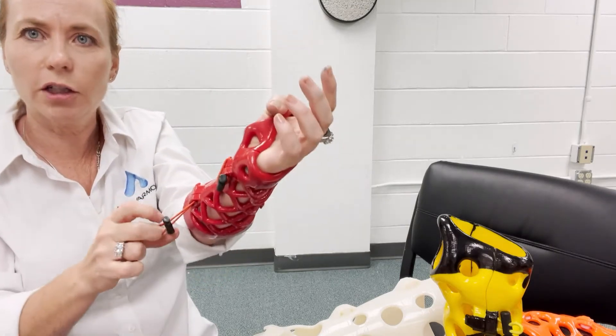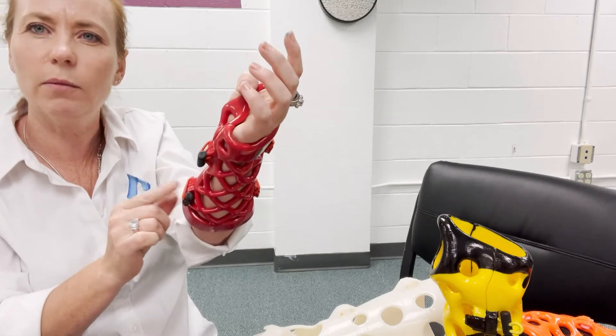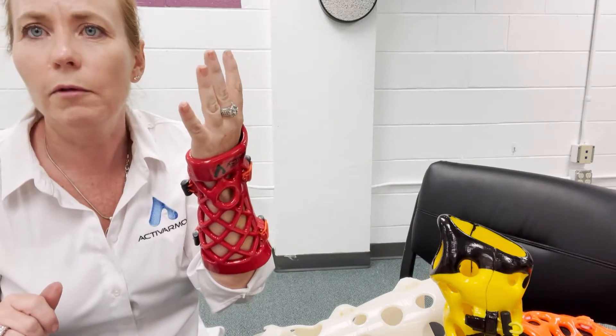Super easy to put on and off. Make sure they snug that toggle right up there, put that loop over the hook, and then you can push that little toggle out of the way. That's how you put on and take off the removable option.